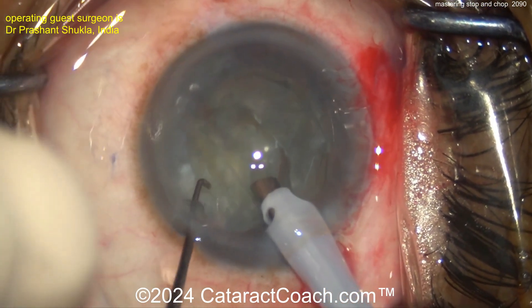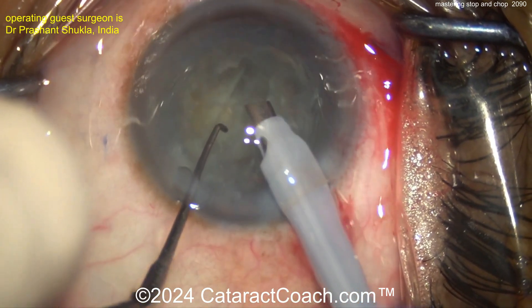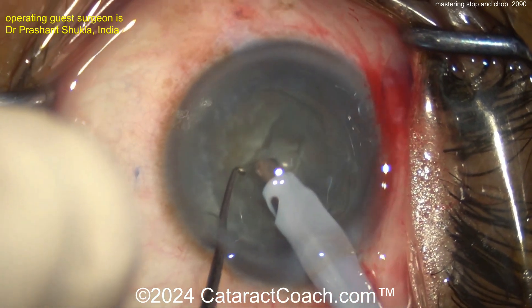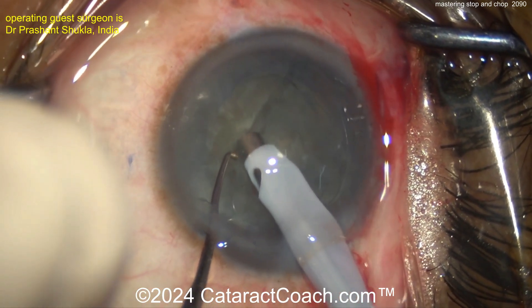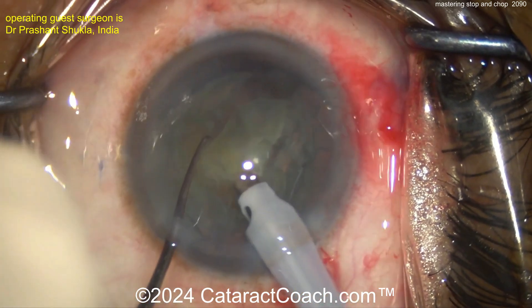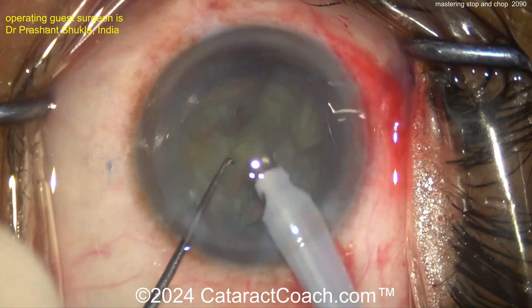By doing the Stop and Chop here, with the groove created, there's a nice wall on that hemi-nuclear piece where you can easily embed the Phaco tip. Look where the Phaco tip is embedded — again, in that wall. High vacuum. When you hear that vacuum, retract your foot off the energy and do just vacuum only, and then it's chopped, and then the piece can be emulsified.